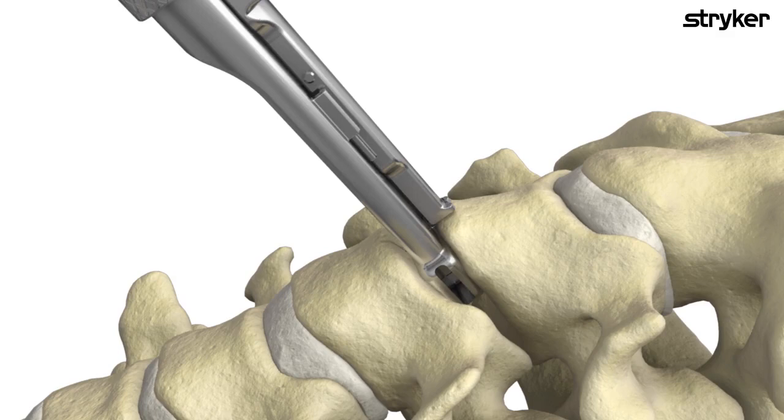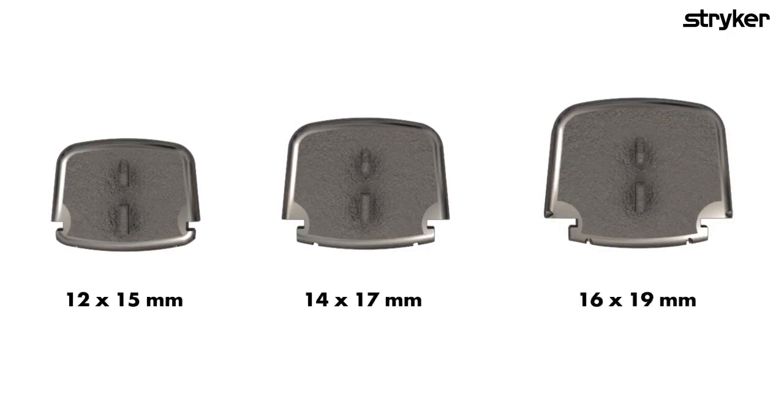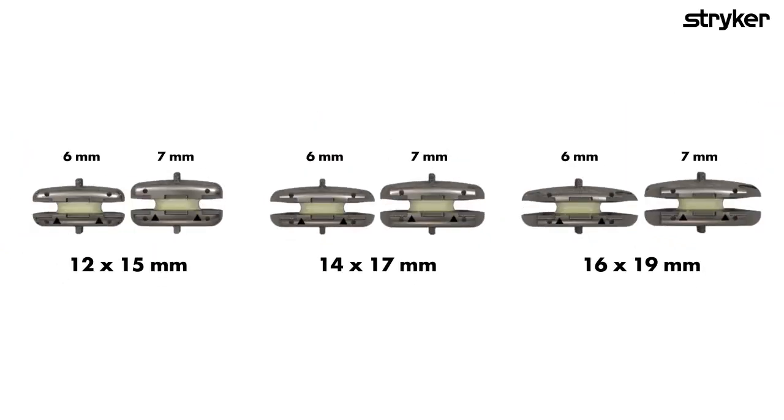Keel pathway preparation can be accomplished simultaneously with trial insertion, or sequentially after optimal trial position has been achieved. Rhine cervical discs are available in 3 footprints, 12 by 15, 14 by 17, and 16 by 19 millimeters. Each footprint is offered in heights of 6 millimeters and 7 millimeters.